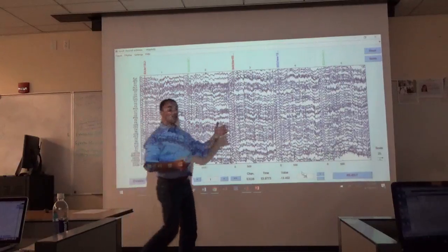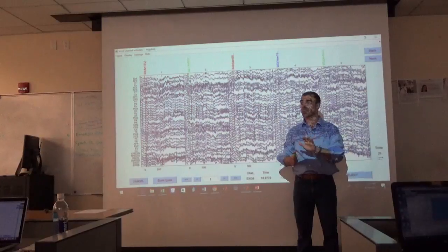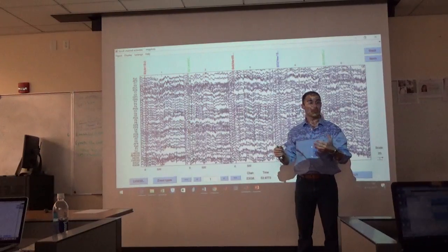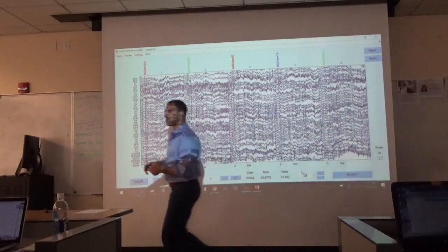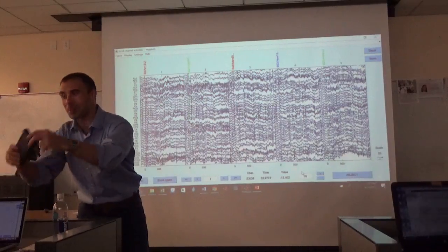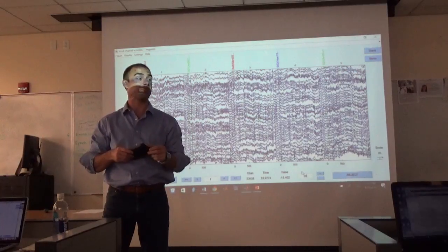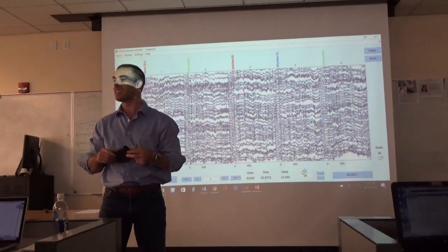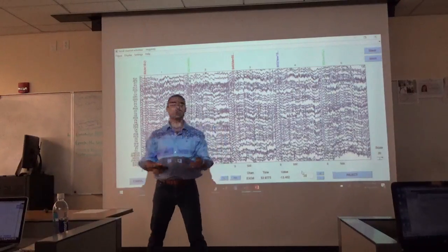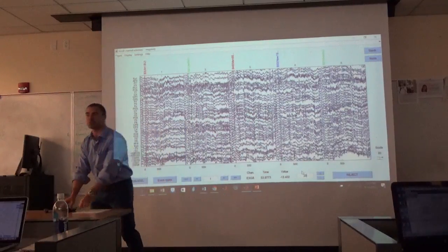The person's crazy, we've got to reject all of this, right? Oh, throw everything out, right? No, no, no, we don't want to throw the baby out with the bathwater. It's just because we zoomed in all the way. If some photographer took their camera and came up to you and took a really, really close-up shot right up on your face, maybe your face might not look as pretty as it usually does, right? You'd be like, no, no, no, get a little bit away so it looks a little bit normal. We're zoomed in really, really close. This is super close in. So we want a normal looking picture. Let's keep it at 75.